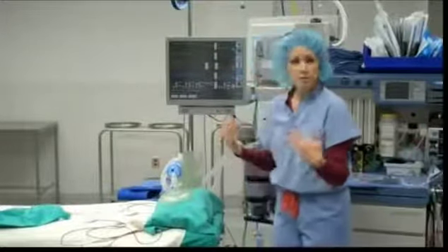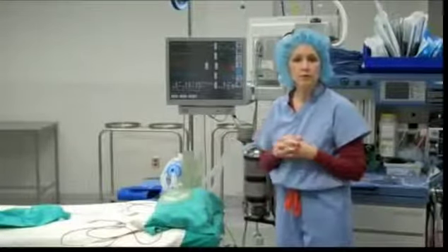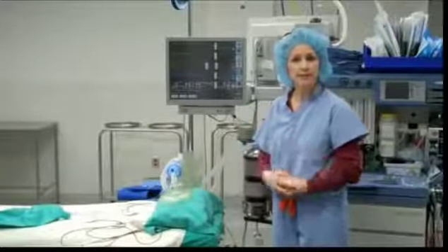So this is just a general idea of exactly what we do back here. I hope it was informative for you, and I hope that it helped give you an idea of how we maintain a general anesthetic. Thank you.